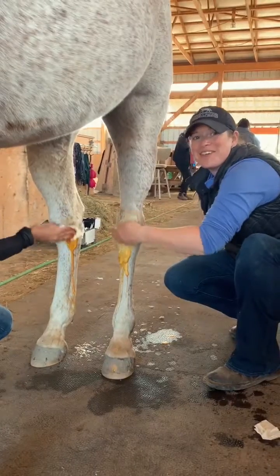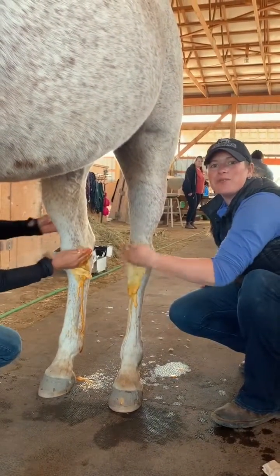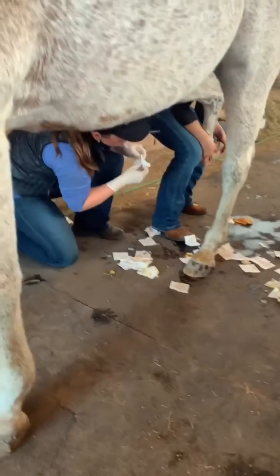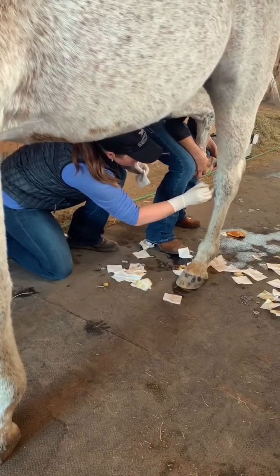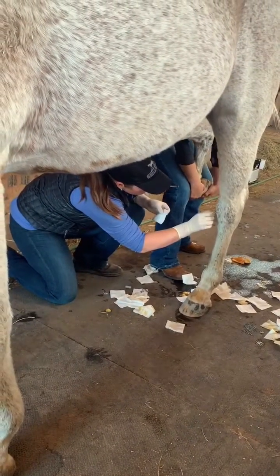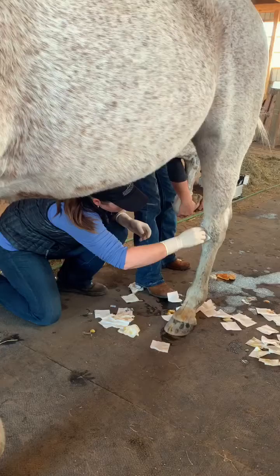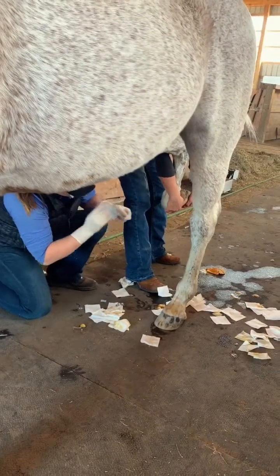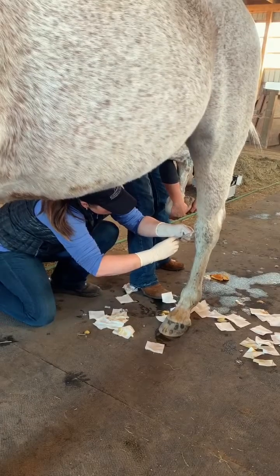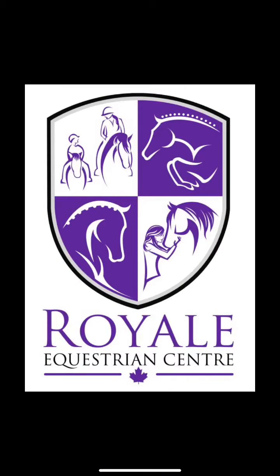We're currently prepping for an interarticular injection with a surgical scrub with iodine soap, so that our injection site is aseptic, which means perfectly clean. Thank you.